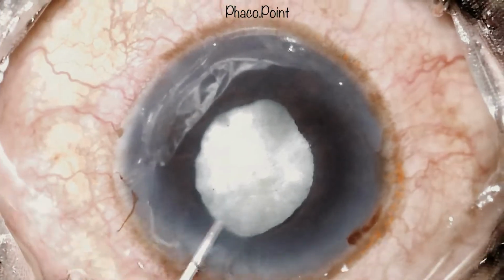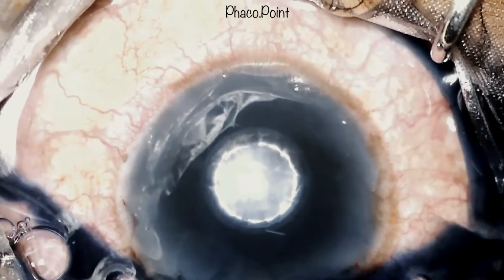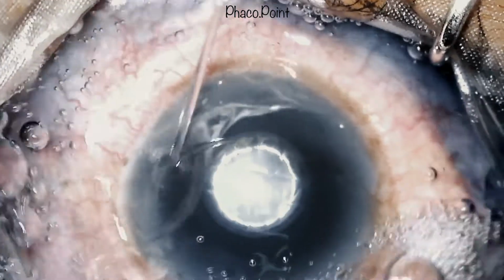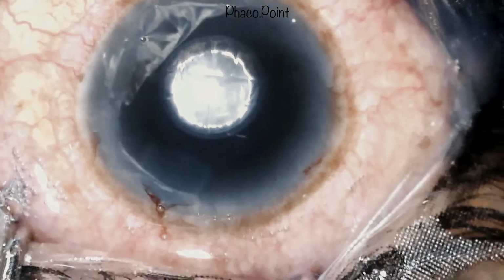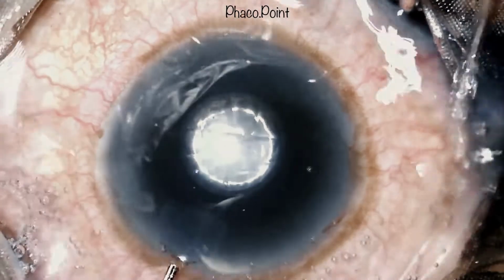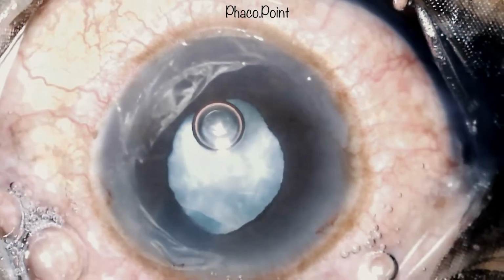Adequate staining of the anterior capsule is extremely important because of the associated lack of visibility that comes in these cases. Staining of the anterior capsule of this mature cataract should be done giving adequate time for the stain to take on. Sometimes in a phacomorphic glaucoma, the space available to actually put in air and then inject dye under it may be extremely limited.